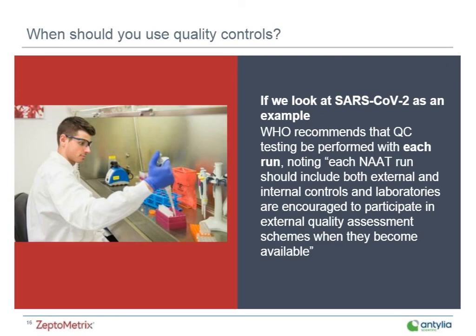So when should you use quality controls? And we'll look at this really through the lens of SARS-CoV-2 as an example. And kind of the name of the game here, I think, is mixed messages. So in the specific case of SARS-CoV-2, the WHO recommends that QC testing be performed with each run. And they note that each NAT run should include both external and internal controls. And labs, of course, are encouraged to participate in quality assessment externally as they become available. So that's what the WHO says.